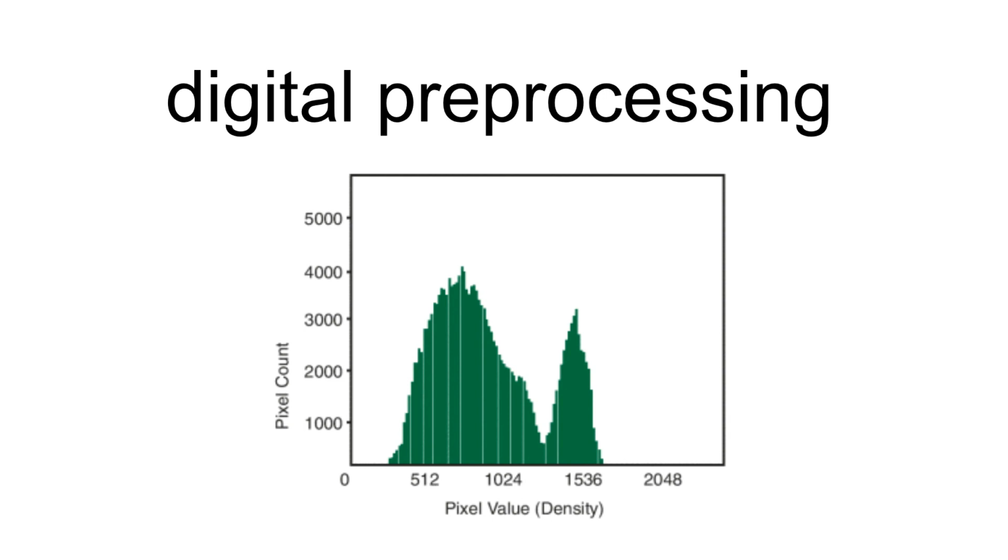CR takes a little bit longer than DR, so DR maybe 10 seconds. What's happening in between that raw image versus your final product, which you can decide, as many techs do, that they don't like it and they want to adjust things themselves. So we'll get to some of those things as well.